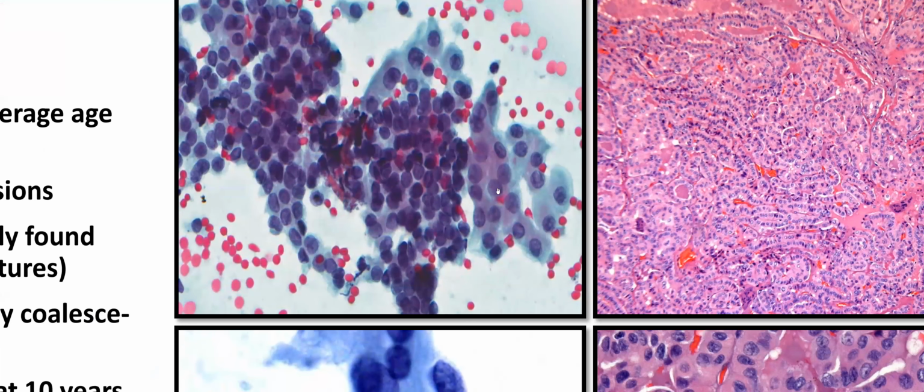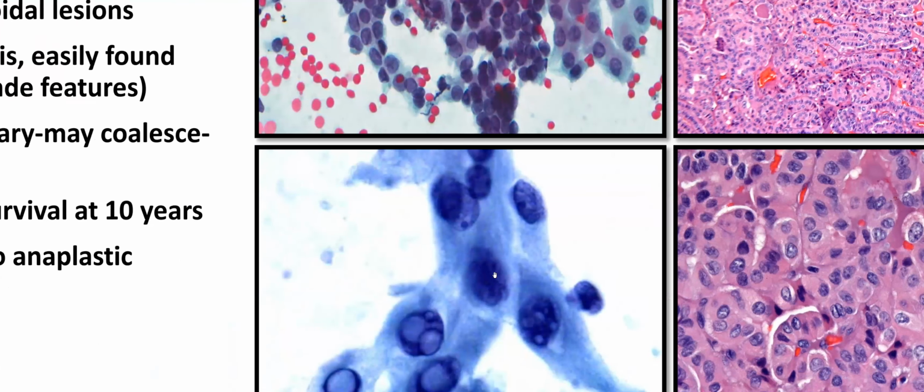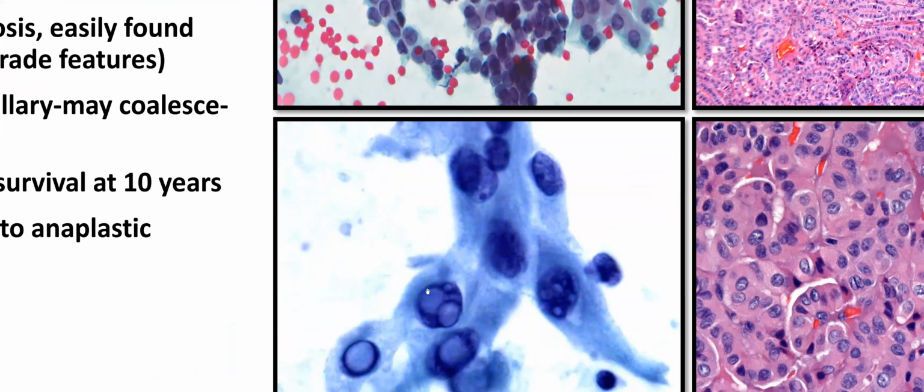You can diagnose them on cytology also because you can see these really elongated cells. But the bottom line is calling these just papillary carcinomas is okay. On cytology, they do show these beautiful soap bubble inclusions. That means multiple inclusions within the tumor cells.